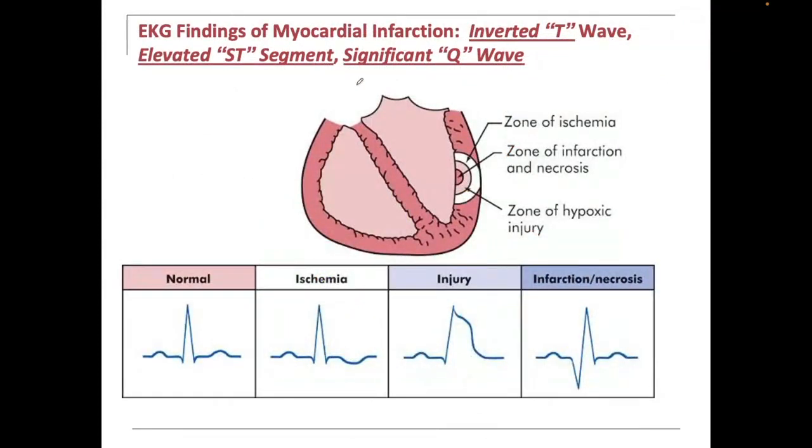So when there's heart damage, like a MI, a heart attack, or a myocardial infarct, we can see here's a P, Q, R, S, T wave, and that one's normal. But look what's happening here. Here's a P, Q, R, S looks good, but what's happening to the T? Well, that's an inverted T wave.